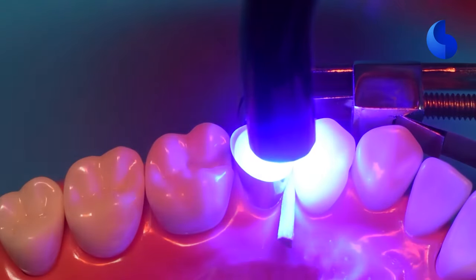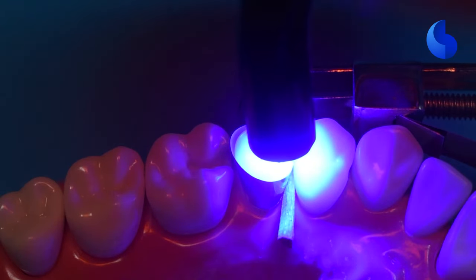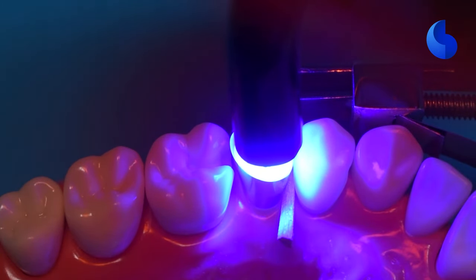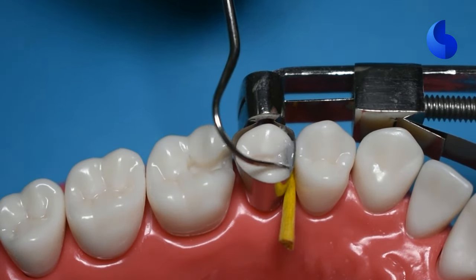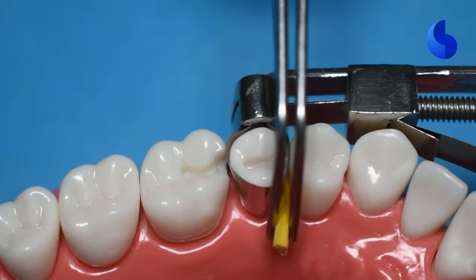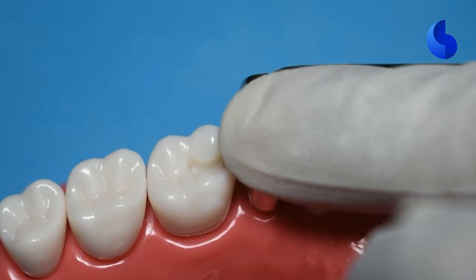Now we're ready to cure this, and we have a marginal ridge, a wall to work with, so that we can start treating this like a class 1 cavity. Now we have a wall, so we can go ahead and take out our wedge and our matrix band, because we already have a wall, and this becomes a class 1 cavity right here.